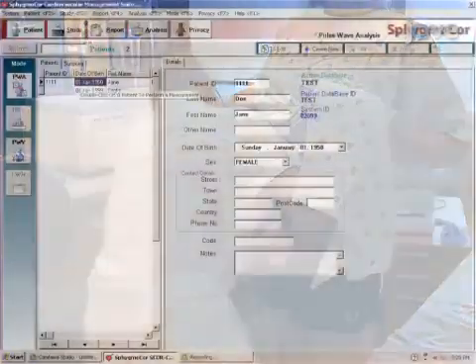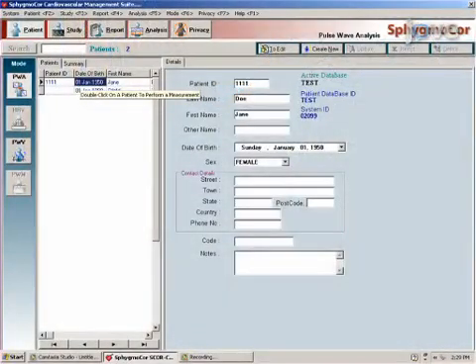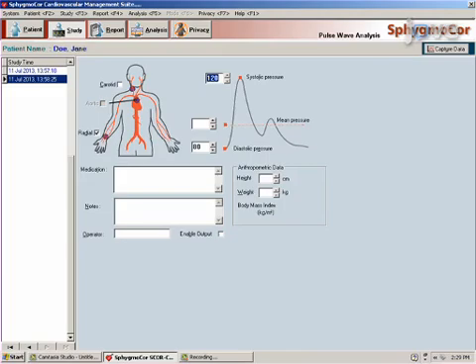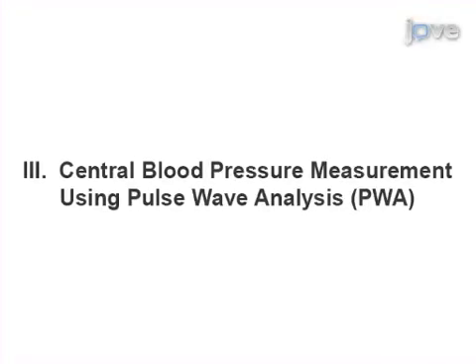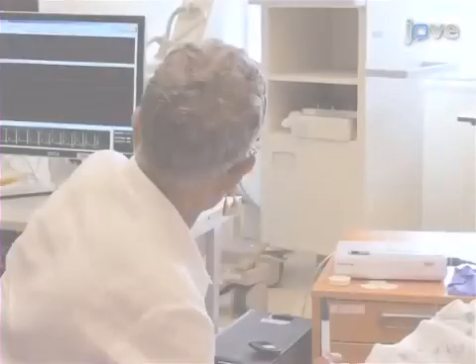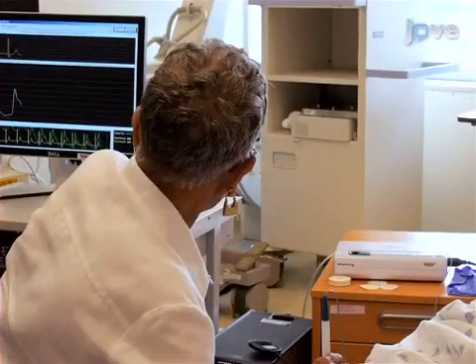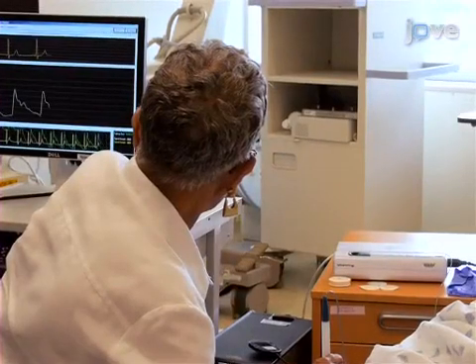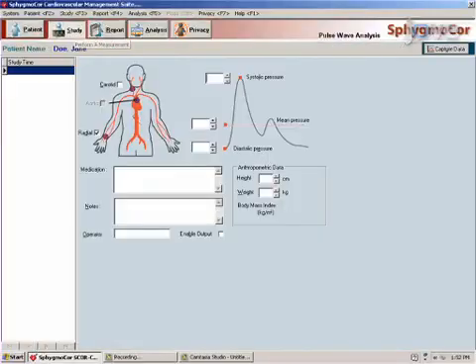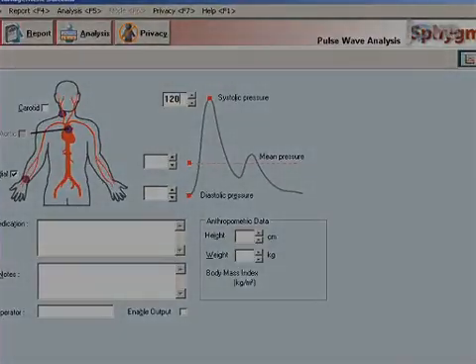Now select the Pulse Wave Analysis or Pulse Wave Velocity button to begin measuring these parameters. If the Pulse Wave Analysis mode was chosen, click Study to enter the patient's brachial pressure as taken from a calibrated sphygmomanometer and any other details pertinent to the study.